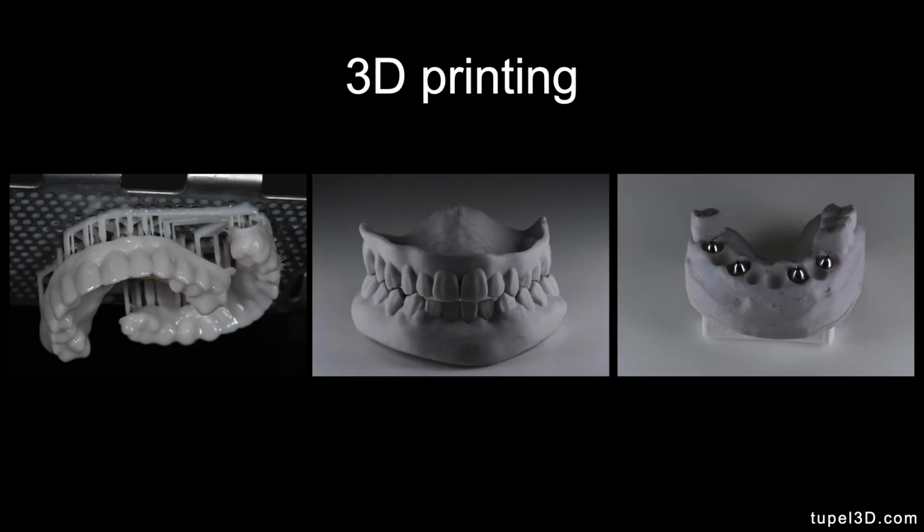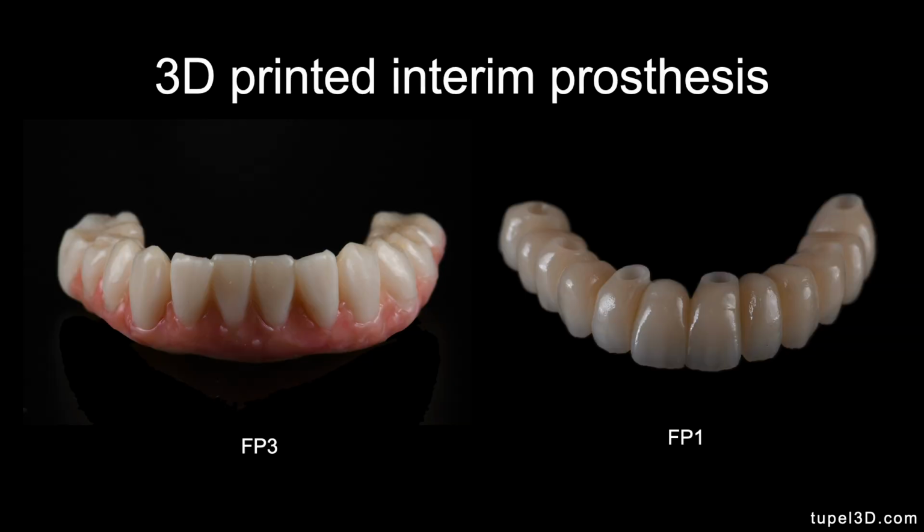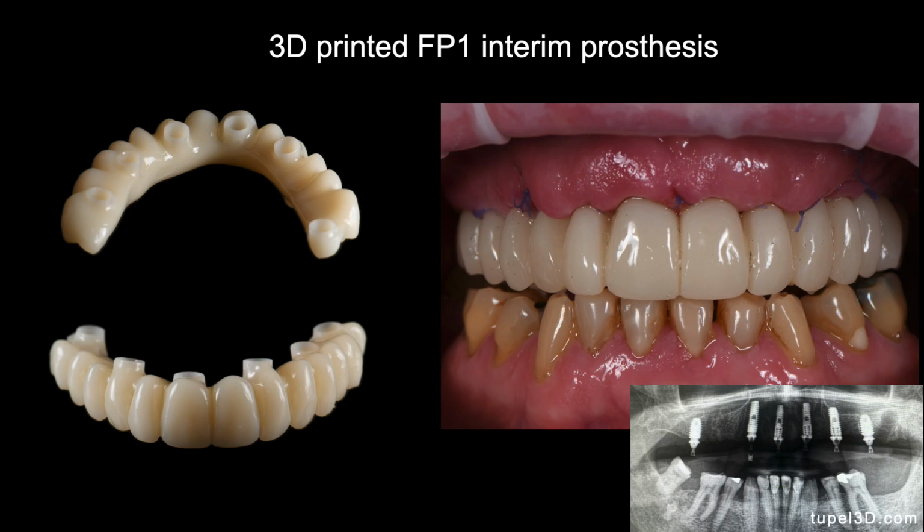Nowadays we have 3D printing available, which is able to give us not only definitive models or pickup dentures or models, but also FP3, FP1 interim prosthesis, and they are extremely aesthetic. Here's another example of how an interim prosthesis is designed and then printed.